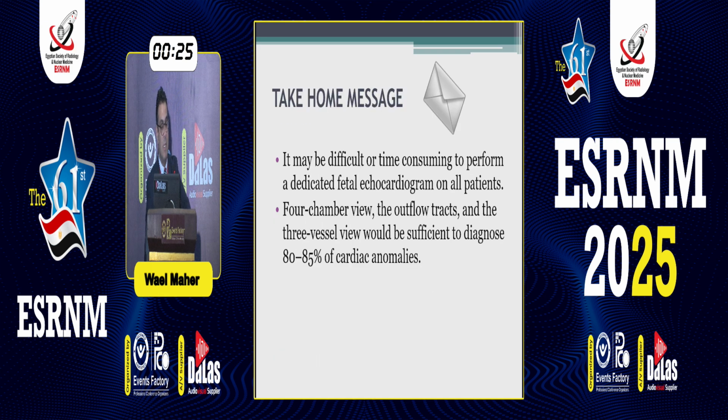So the take-home message is that it might be difficult and time-consuming to perform a dedicated scan, but actually you need to do it following the indications that I've just mentioned. And if you are acquainted with the four chambers view, the outflow tract, and the three vessels view, it will be sufficient to diagnose 80 to 85% of the common cardiac anomalies.